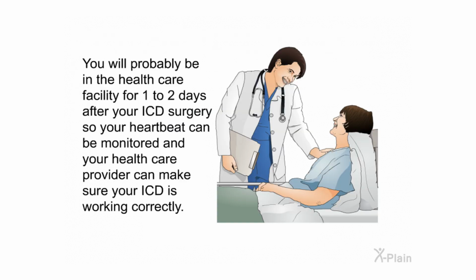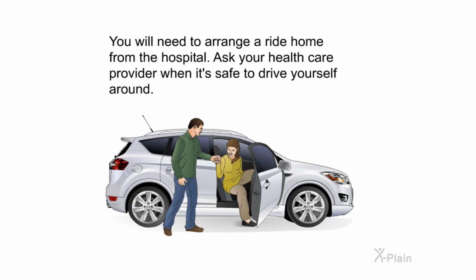After surgery. You will probably be in the healthcare facility for 1 to 2 days after your ICD surgery so your heartbeat can be monitored and your healthcare provider can make sure your ICD is working correctly. You will need to arrange a ride home from the hospital. Ask your healthcare provider when it's safe to drive yourself around.